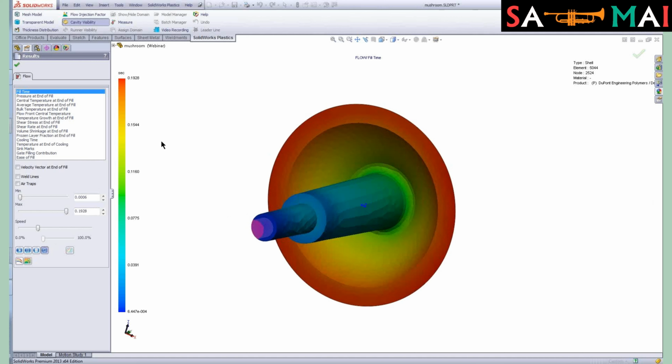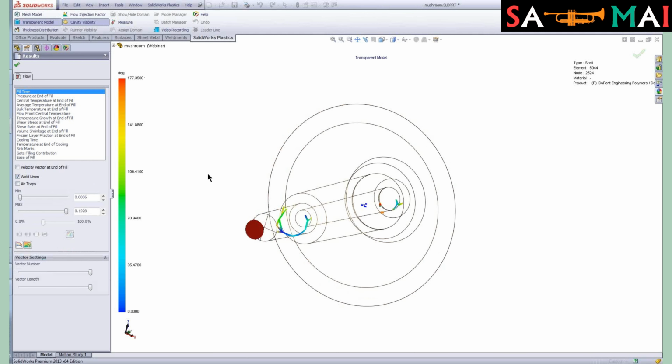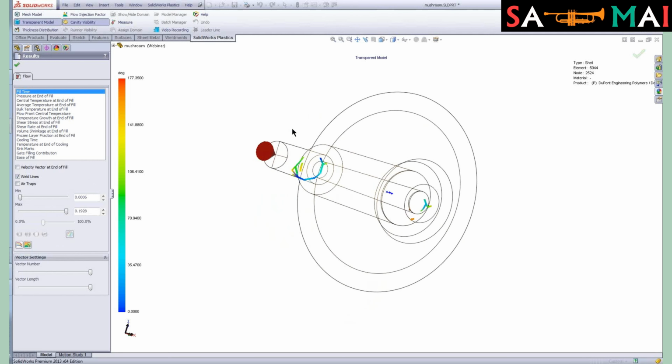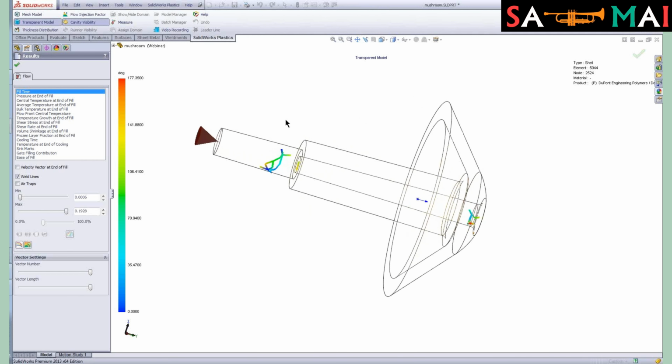Other things that we might be interested in as designers are weld lines. Now, since this is a fairly uniform part, we're not going to have too much in the way of weld lines, but a weld line is where the flow front of the plastic is separated and then rejoins somewhere after the gate. And why a weld line is important to us is it can be thought of as like a defect in the part. It can cause cosmetic issues on the surface of the part. So these are things that we would want to know. For instance, if this region right here where we see the weld lines very close to the gate is structurally important, we might have to do some things with our design to make sure that we can move those weld lines around.